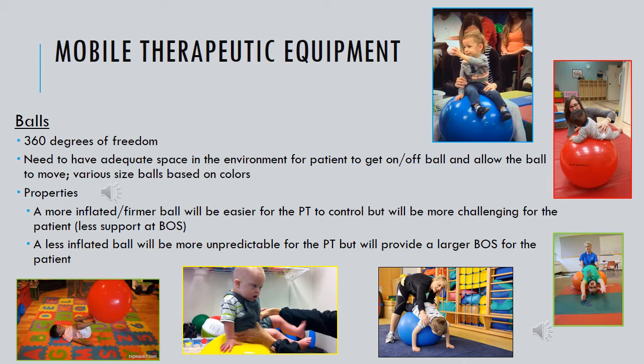Another factor to consider in selection of physio balls would be the level to which that ball is inflated. A more inflated, or a ball that's firmer, will be easier for the physical therapist to control because it will be a more predictable movement. But that ball will be more challenging for the patient because they'll likely have a smaller base of support with a firmer ball. The converse of that would then also be true.